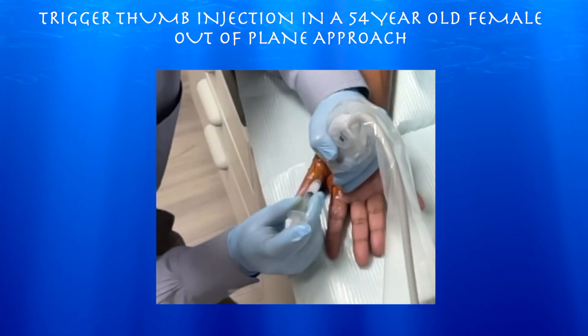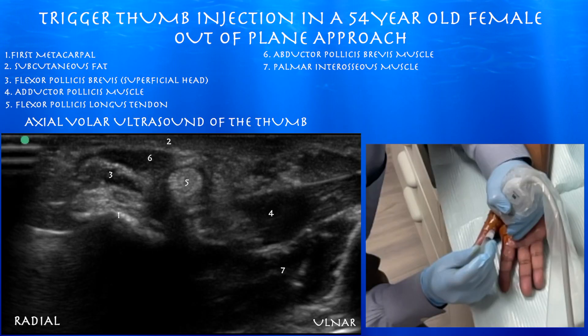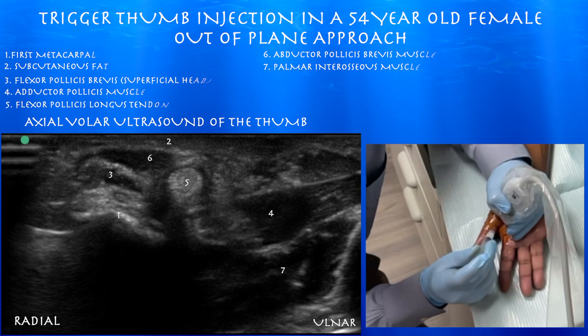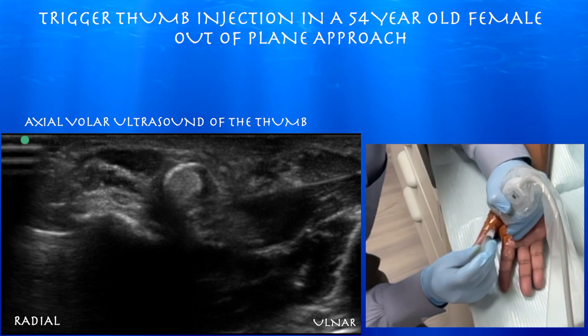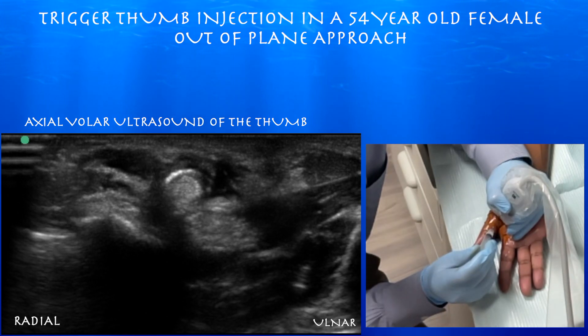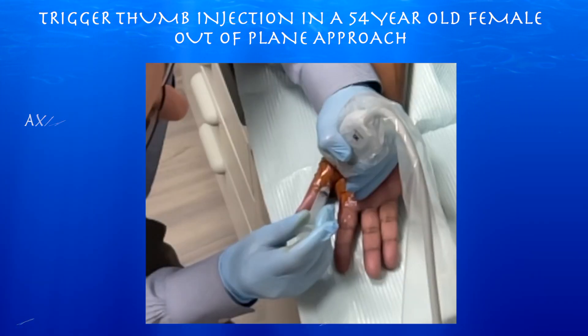In this approach, we're trying to essentially get the flexor pollicis longus tendon in the middle of the screen and line up the arrow of the probe with the middle of the screen, so we know where to put our needle. We're essentially just trying to get our needle right on top of that flexor pollicis longus tendon. Here you can see that flash of injectate surrounding the tendon and filling the tendon sheath.